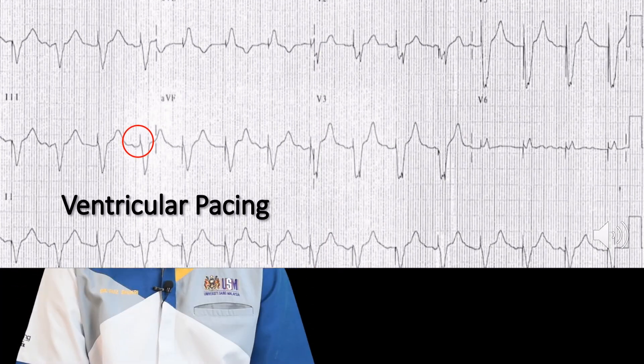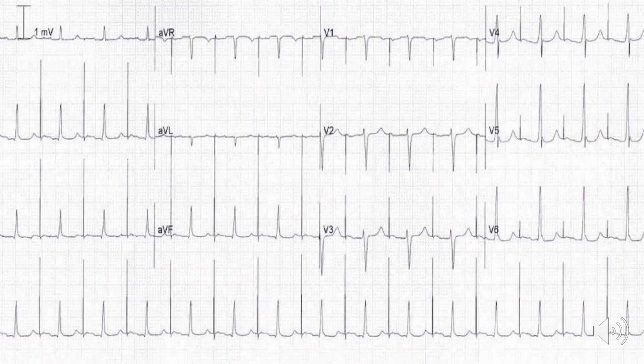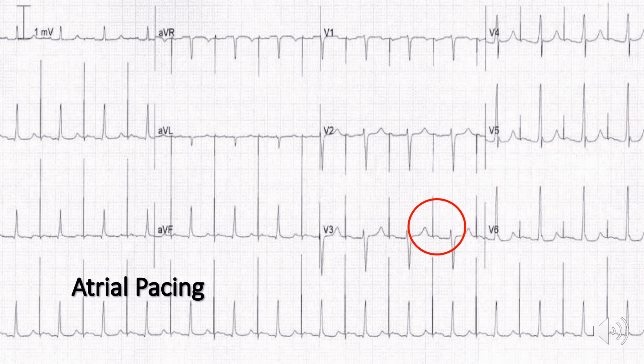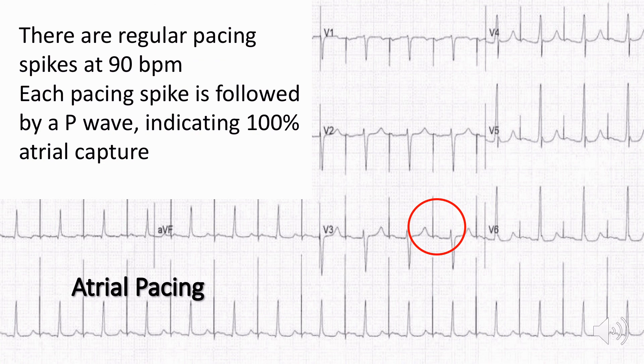The next example is an atrial pacing ECG. In this ECG you can see regular atrial pacing spikes at 90 beats per minute, and following each pacing spike there is a P wave, indicating 100% atrial capture. That concludes our first part on pacemaker rhythm ECG.